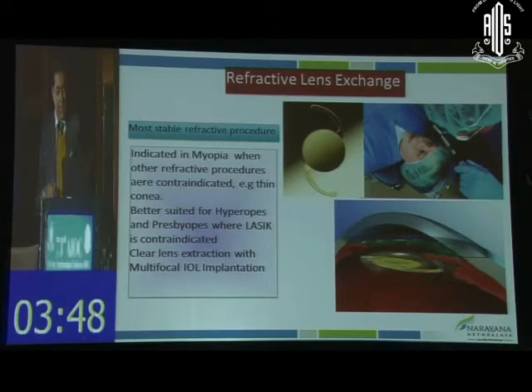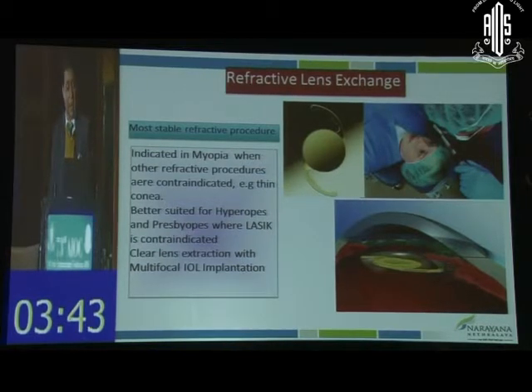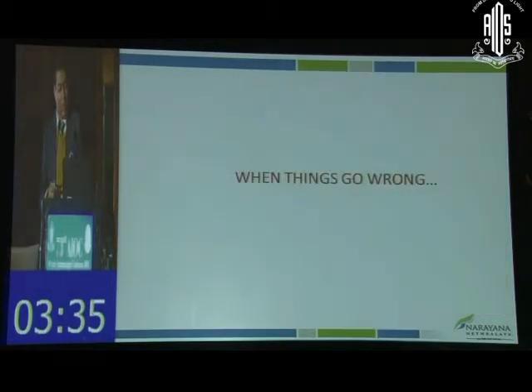However, at this point in time, if the patient is very keen that he or she wants to get rid of the glasses completely, then I think the most predictable of all this, if the patient is willing, is still refractive lens exchange, where you can use multifocal lenses.